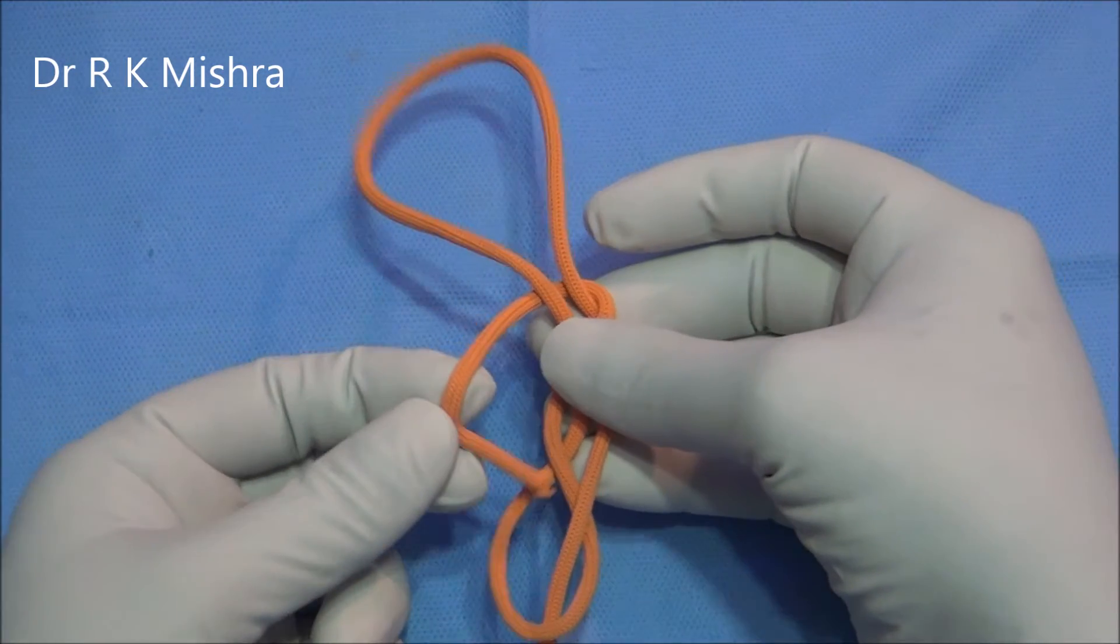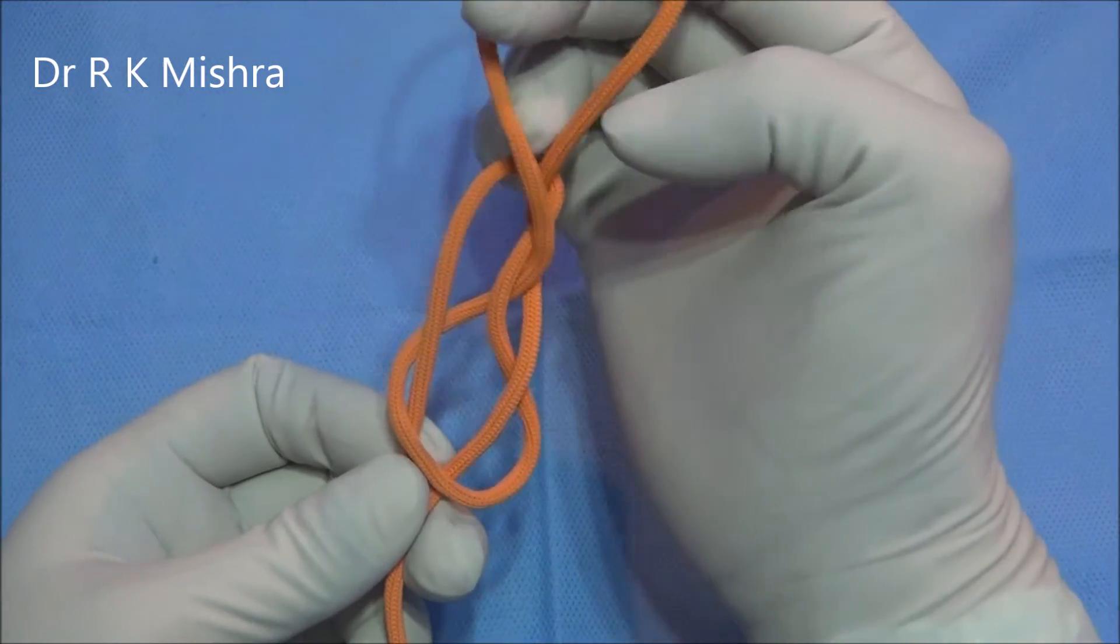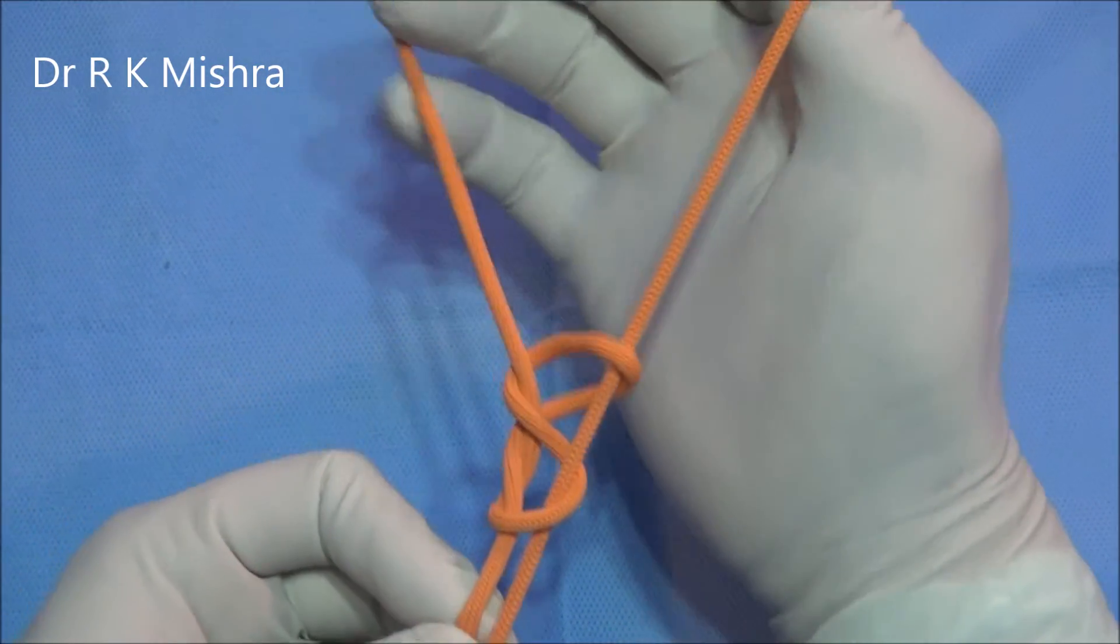Finally, introduce it into the first hitch. And it is done. This is the Western Knot.